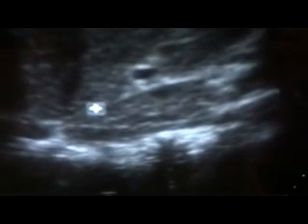This is the left lobe of the liver. This is the ligamentum venosum. This is the inferior vena cava, and in between is the caudate lobe of the liver. This is part of the portal vein, and this is the hepatic artery. Left hepatic vein entering the IVC. The echogenicity is normal and homogeneous.